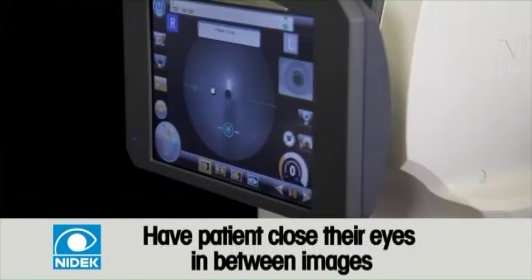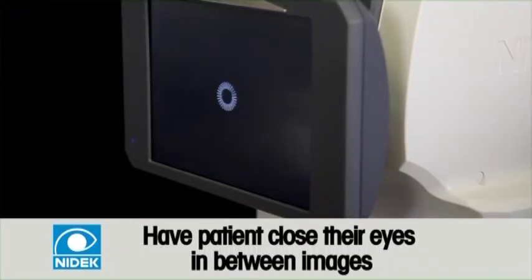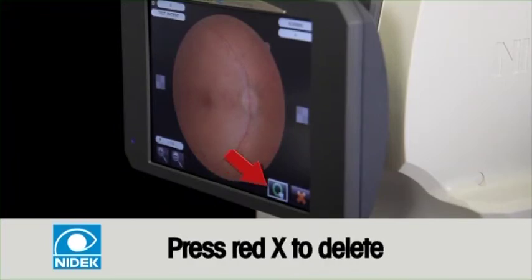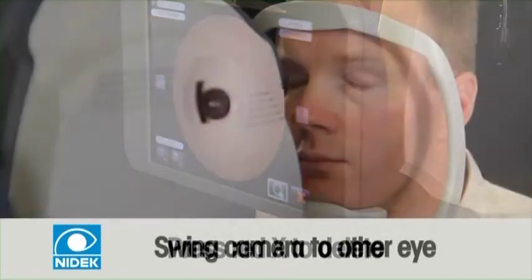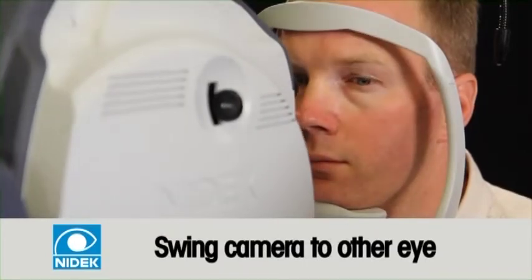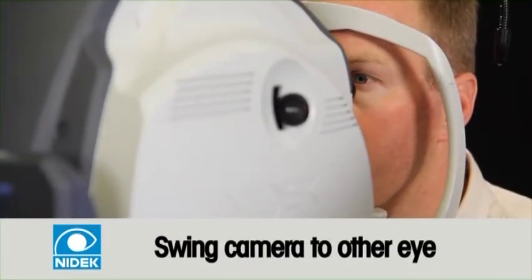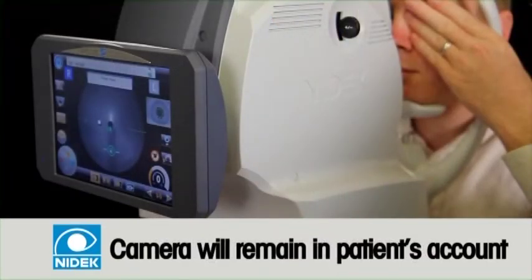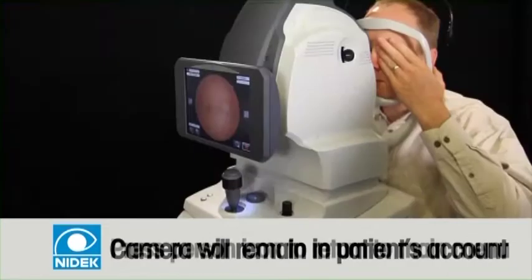capture. After the image is captured, have the patient close their eyes until the operator is ready to capture the fellow eye. While the patient's eyes are closed, press the green circle to accept and save the image, or the red X to delete and retake image. If the image is accepted, pull the camera all the way back to the operator and swing the camera to the other eye. The camera will remain in the patient's demographics for the following eye. Have the patient cover their first eye and proceed to capture the image.